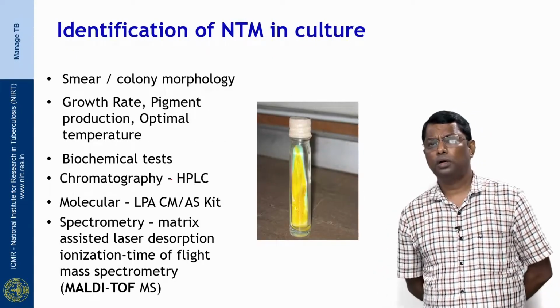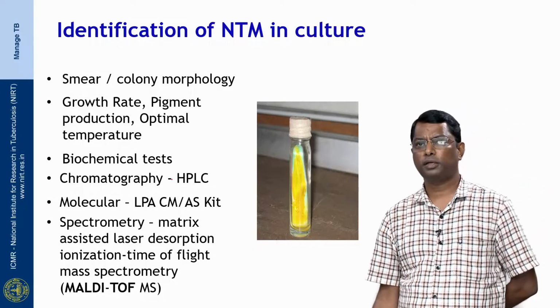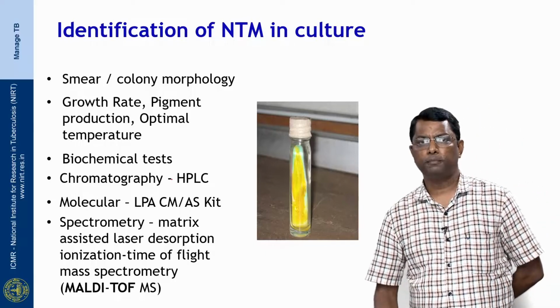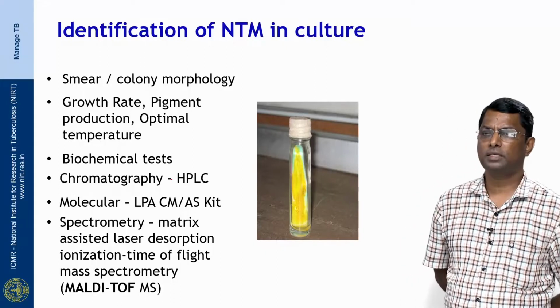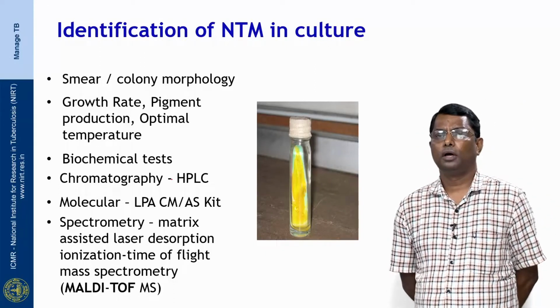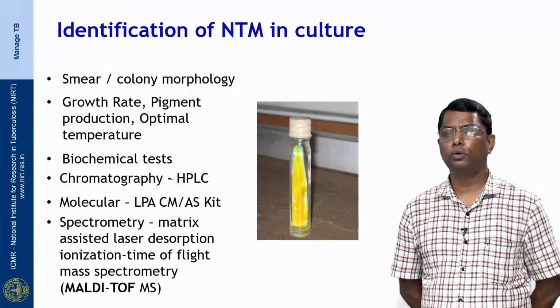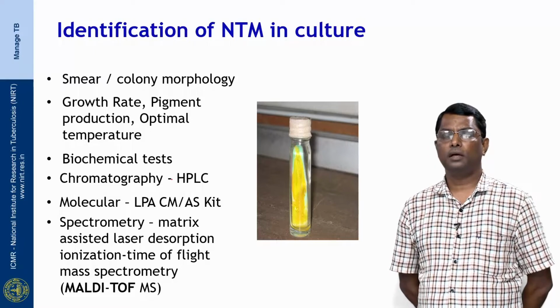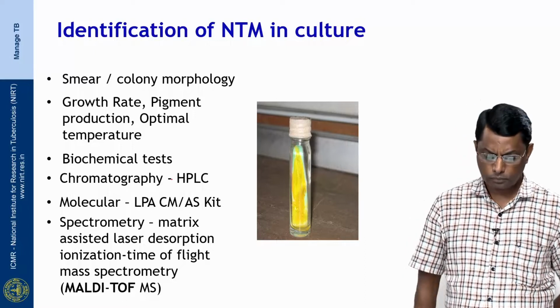Now we will come to a different arena, which is non-tuberculosis mycobacterium, or popularly known as NTM. Apart from Mycobacterium tuberculosis complex, Mycobacteria has other species of Mycobacterium which are also important for identification and for the treatment of a patient.